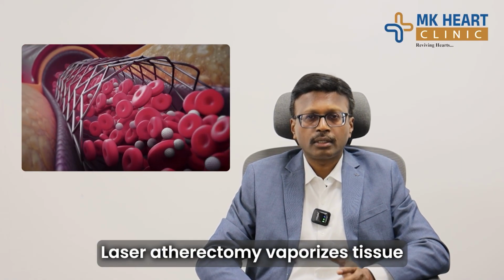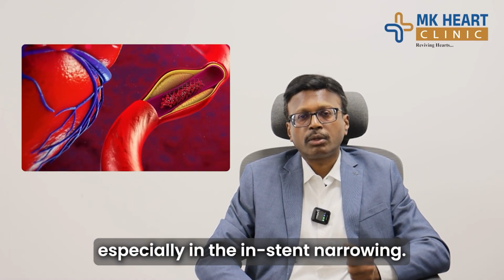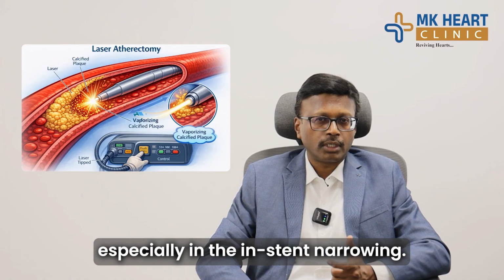When you implant a stent, 4 to 5% of the individuals can develop blockages inside the stent because of the growth of the tissue. This tissue can be vaporized by using the laser catheter, which is called the laser atherectomy. Sometimes calcified lesions can also be broken with the laser atherectomy.